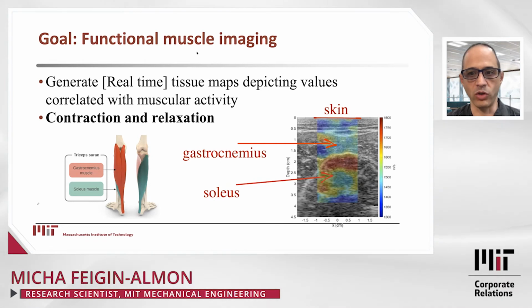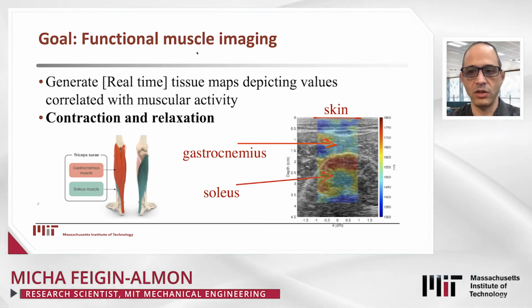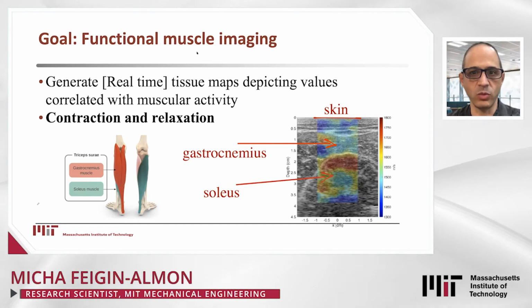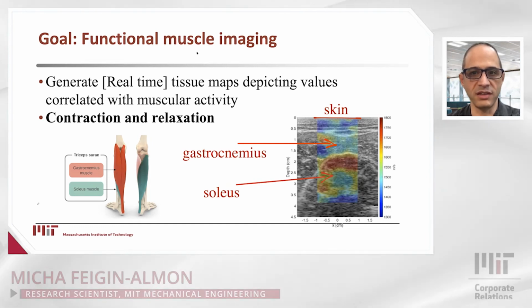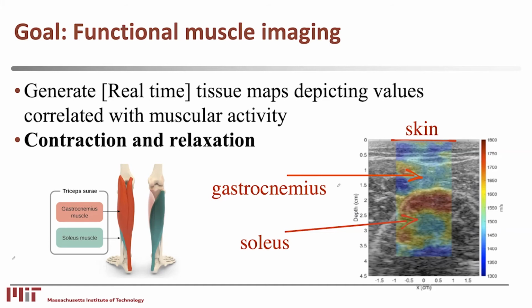Muscles are designed with work in mind. Their job is to contract and produce force. This can be isotonic work, moving a limb through its range of motion, or isometric work, stabilizing a limb without moving. The teaser example shown here shows contraction of the soleus muscles.